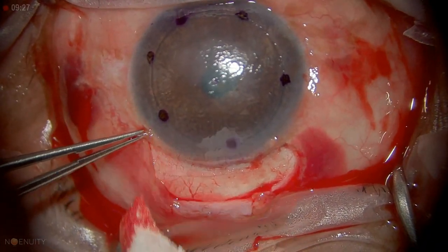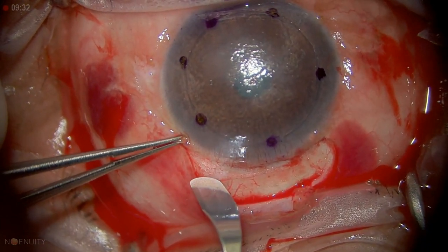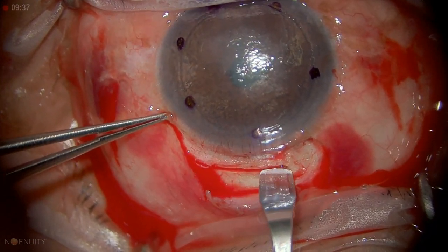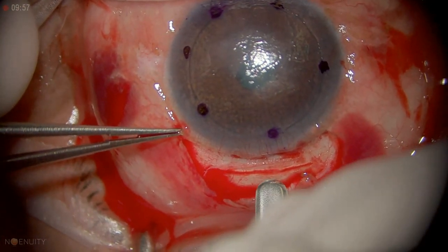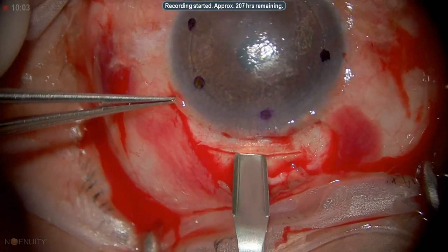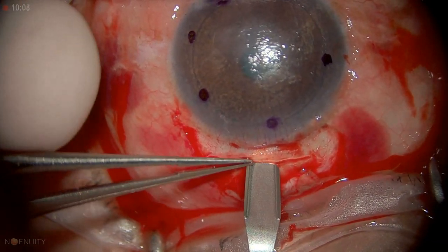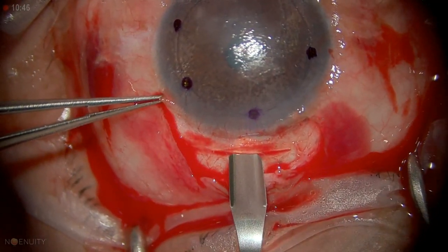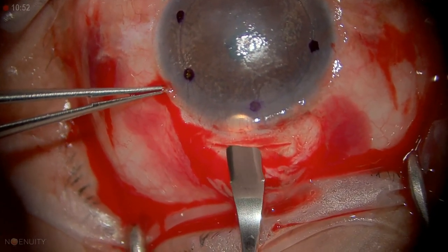We're going to make a scleral groove. You want to go about half scleral thickness — around 400 or 500 microns. You start to see a little bit of the bluish tint of the choroid underneath to gauge depth. Now I have enough depth where you can see the blade, but there's some thickness to it — you're not about to perforate. I'm flat here, and now I'm burrowing up into clear cornea, passing the limbal vessels. That's about as far as I need to go.